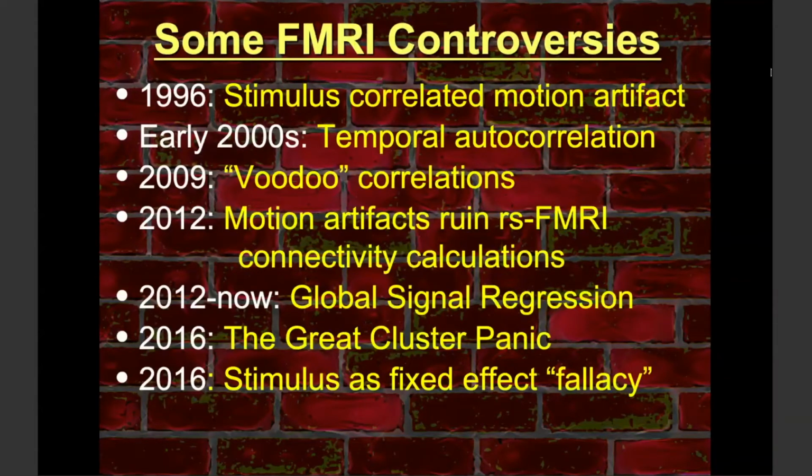That is, by using this fMRI data to extract the voxels only of interest, the ones that are above some threshold, and then use the same data and correlate that with, say, subject's nose length or some other parameter about the subject. That's semi-circular reasoning, because you're selecting voxels that already passed one threshold, then you're going through another threshold, but you're treating the statistic on the correlation coefficient of the second step as if it was a single thresholding step. And that tends to exaggerate the correlation, so that a correlation that might have been, if you used independent data, 0.5 might come out as 0.7 or something like that.